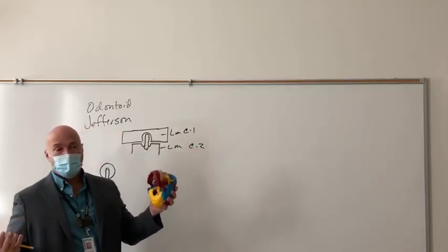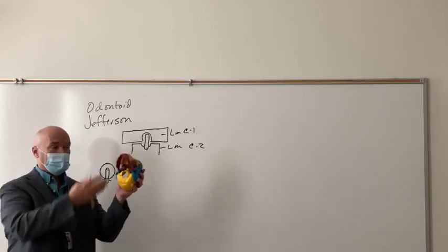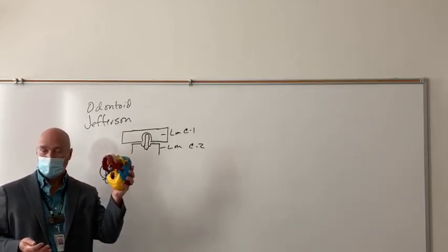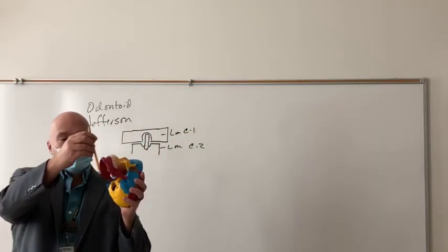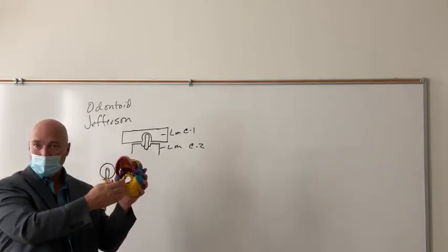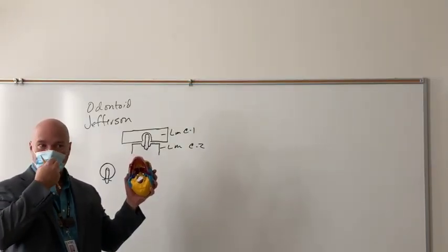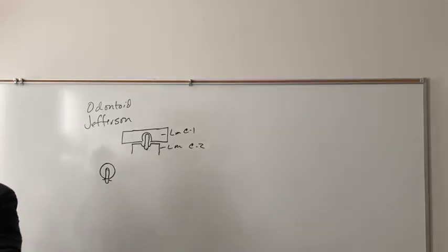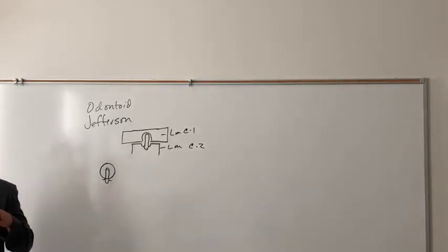and really most of the time the patient's in a collar, they're going to come in with their neck in extension enough that it puts the mentomeatal line pretty perpendicular to the image receptor. It might not be perfect, but what could you do to project the base of the chin over the base of the skull, or the middle point over the base of the skull? Again, angle your central ray, right? Okay, so going all the way back to fingers and toes, what happens if we put an angulation on something and we want to see joint space? We're going to see it very well? No, it closes it up.